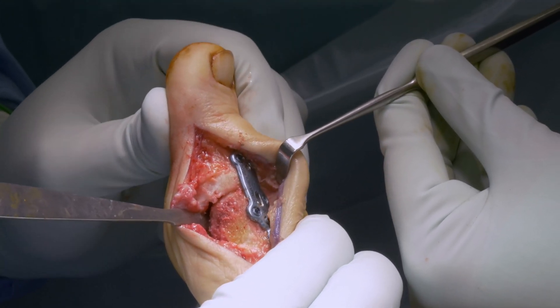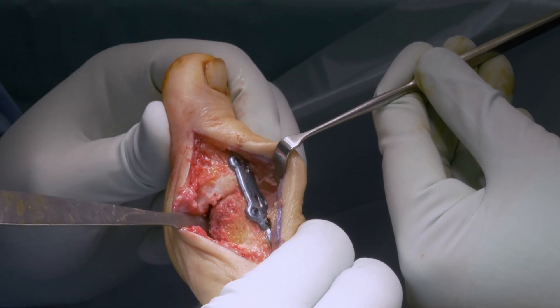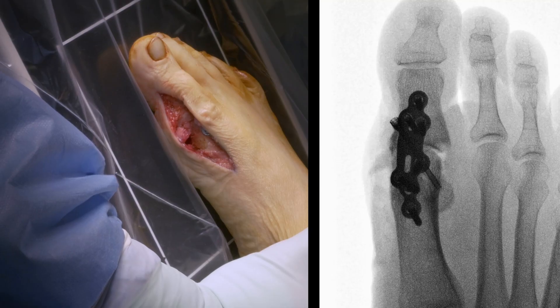Now the joint is completely stable. Final control of the position with simulated weight bearing under the fluoroscan.